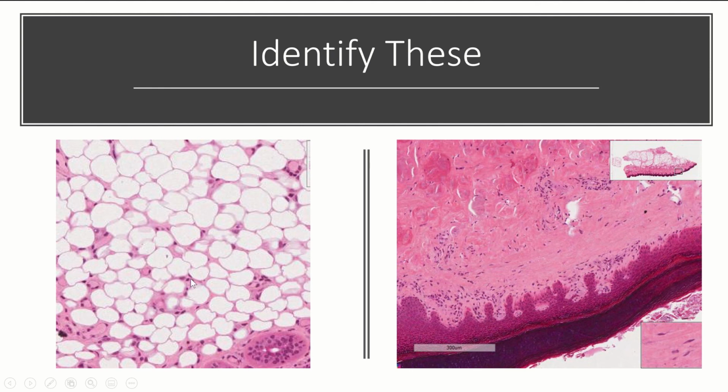These little dark nuclei of the fibroblasts, but there are very few bundles, right? It's very white and blank. There are very few bundles of connective tissue compared to how many fibroblasts there are. So I would call this loose connective tissue. They are not all running in the same direction, so I would call this irregular.